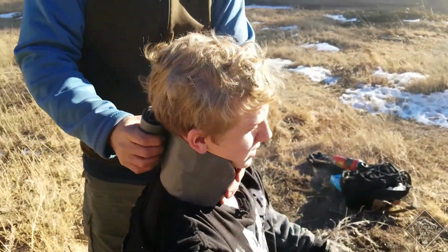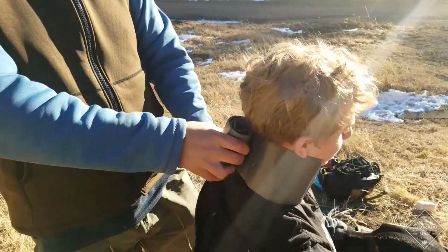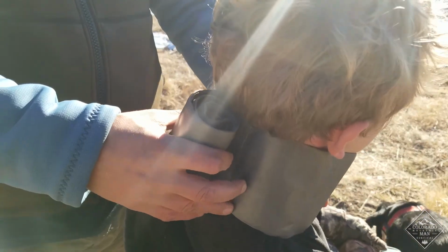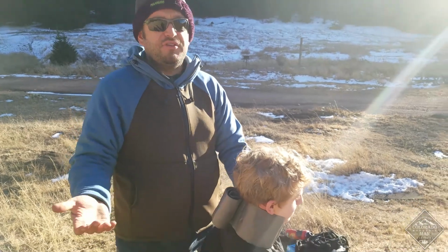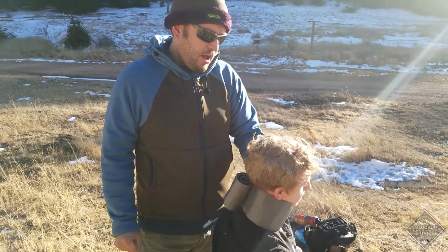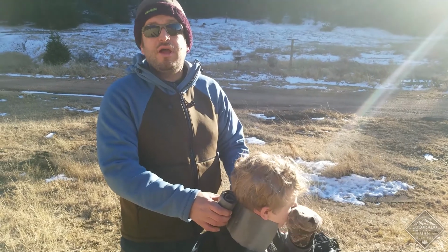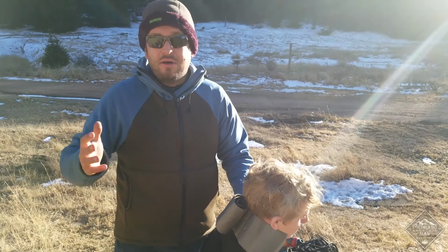And we can adjust it a little bit there if we can pad it or make a deeper angle in there. But essentially, we've got a C-collar on here, and his cervical spine is immobilized, and that only took a minute to put on. You can do it when they're laying down. I'll show you a different technique for laying down in just a second here. But we've protected their spine. Now they can do their rapid assessment. Or if you've decided that you're going to have to keep that C-collar on, then you can keep that on while you're carrying them out or whatever you're doing.